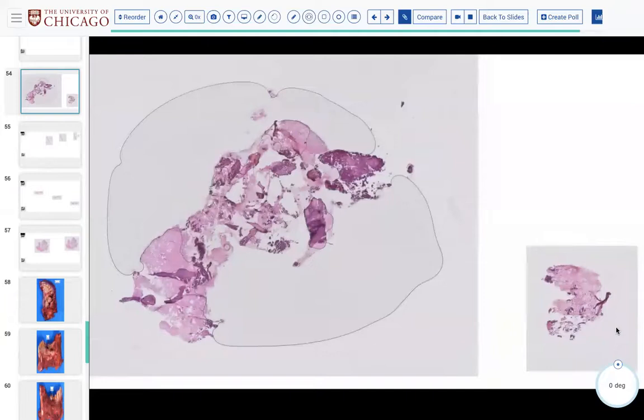All right. So then they send you the anterior mandible margin. And so what does that mean? If you think about when they're cutting through the mandible, right, you have cortical bone on three sides. You probably have a tooth here. You have mucosa.